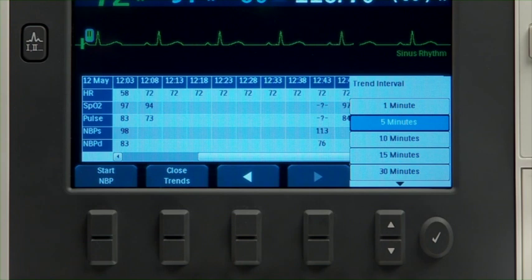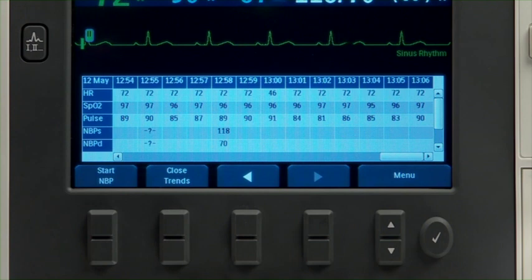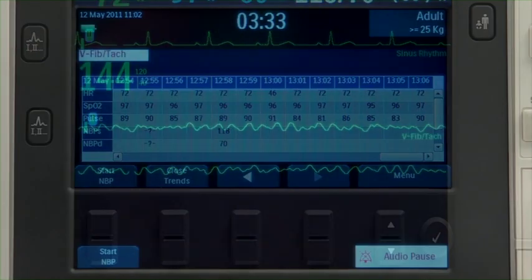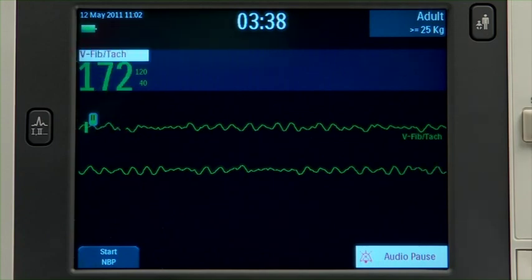The HeartStart XL Plus stores up to eight hours of monitored trending data that can be displayed in time intervals on the screen. While monitoring, alarms alert you to changes in the patient's condition.